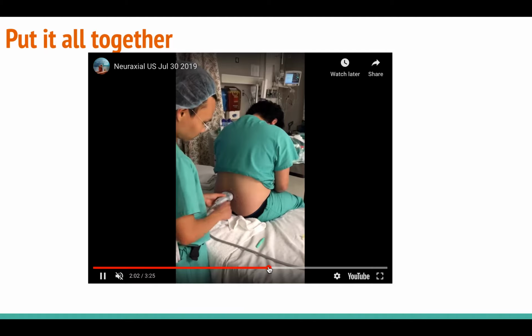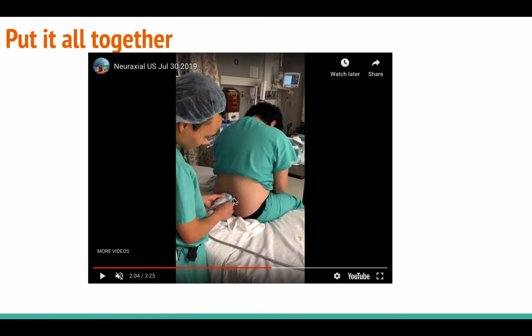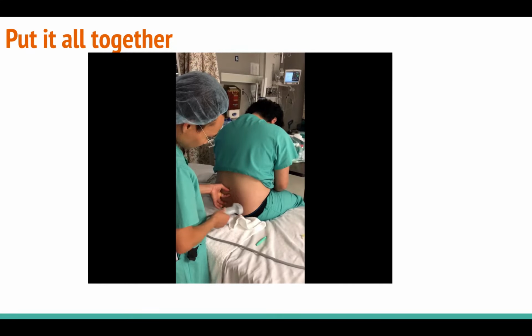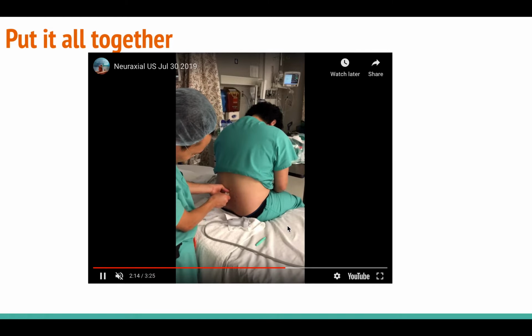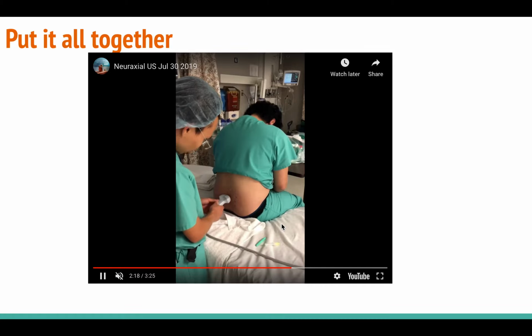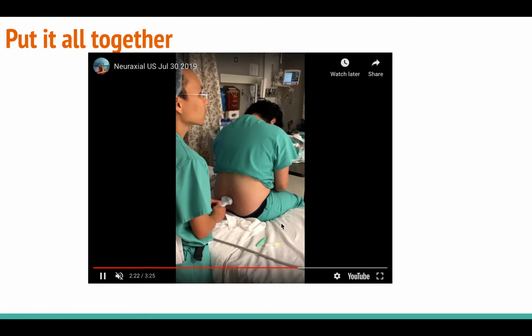Alright, so now I'm going to mark the entry point of my needle. I'm going to mark the midpoint of the short edge of my transducer and the midpoint of the long edge of my transducer. I'm just trying to show you here. I'm not doing it because there's so much gel. So instead I'm doing something a little bit different. I'm using the back of my needle. That is the midline and my interspace. The spot I just marked with my needle is going to be the entry point for your needle.